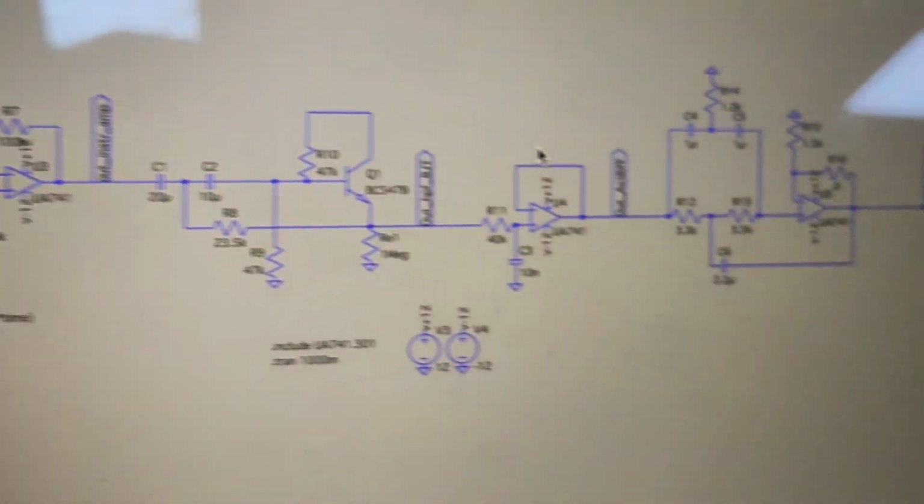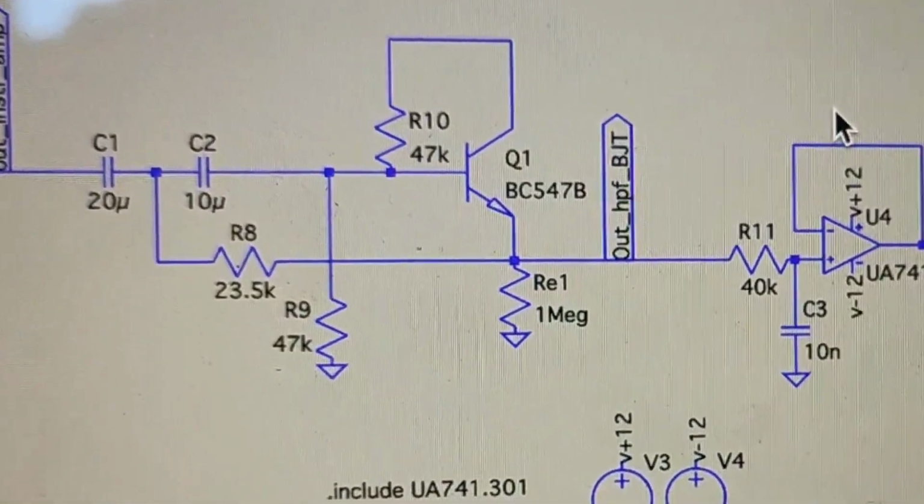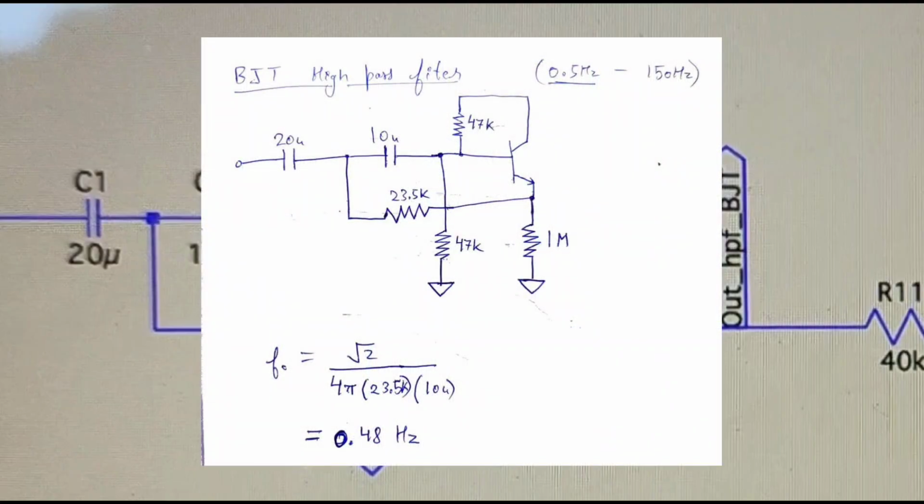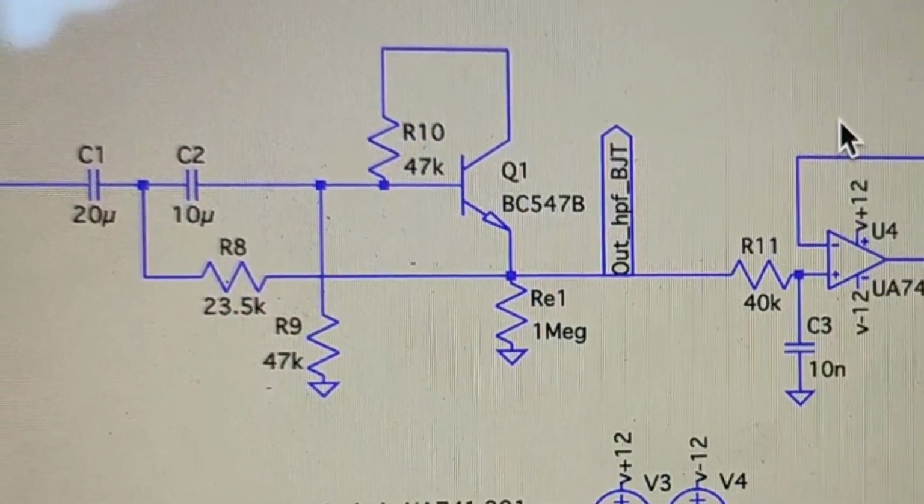After amplification, our signal passes through a high-pass filter. This filter removes baseline wander and very low frequency artifacts. The cutoff frequency is calculated approximately as 0.48 Hz. This means that frequencies below 0.48 Hz will get attenuated, while frequencies higher than this will pass through.